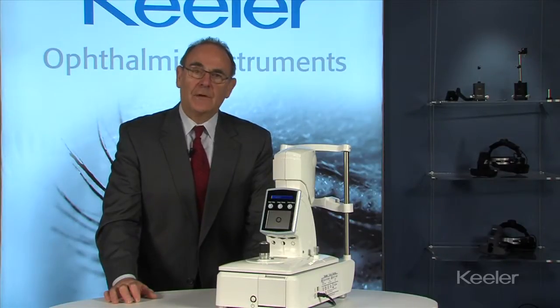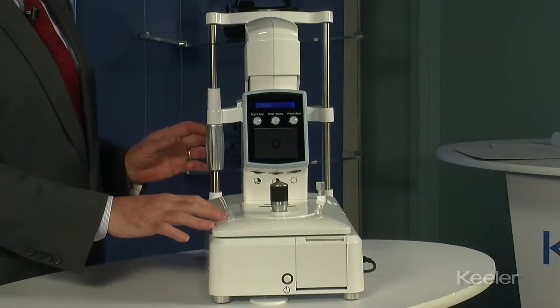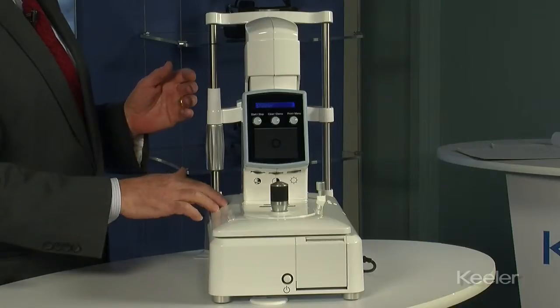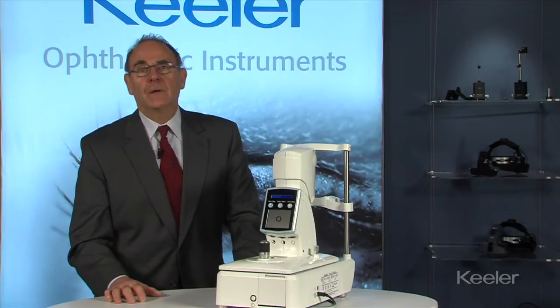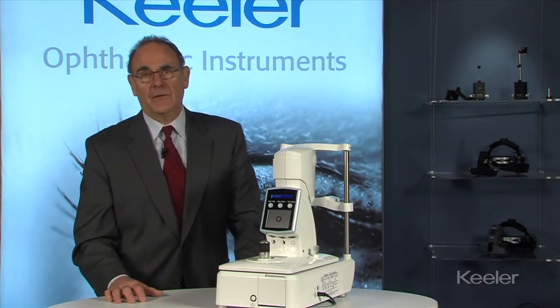The footprint on this instrument is very small and that makes it very easy for the operator to see around the instrument and position it on the patient. The illumination on the desktop Pulsair is LED so you don't have to be concerned about changing bulbs, and the price point on this instrument is excellent.